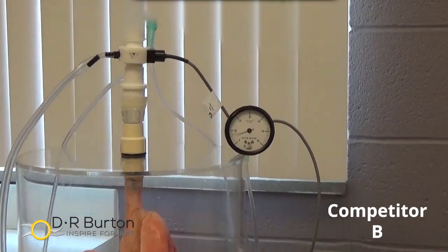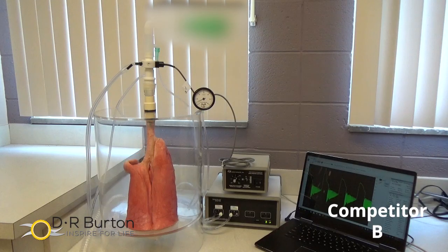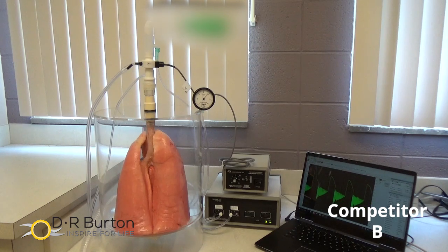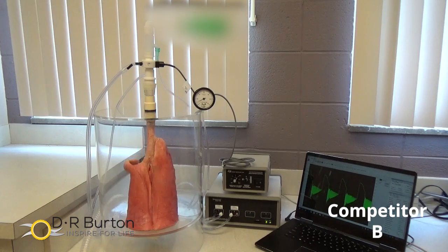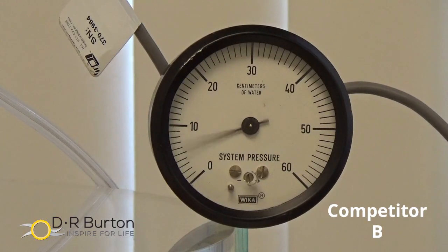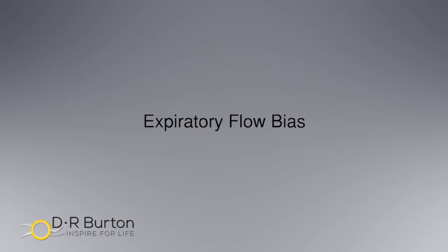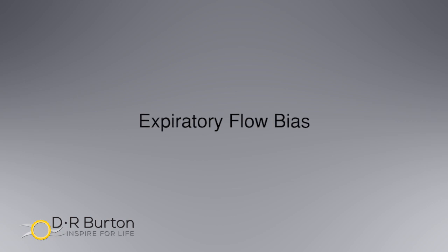Lastly, we set up the lung box with another competitive OPEP device. The visual FRC is also less. The EELP is registering about 1-2 cm H2O, also lower than the VPEP.